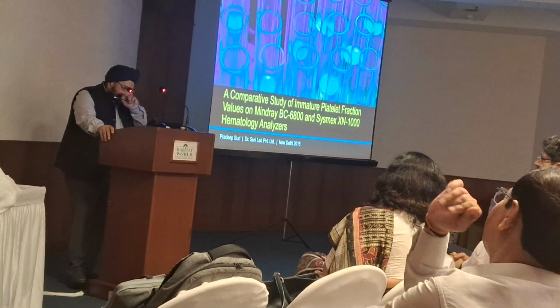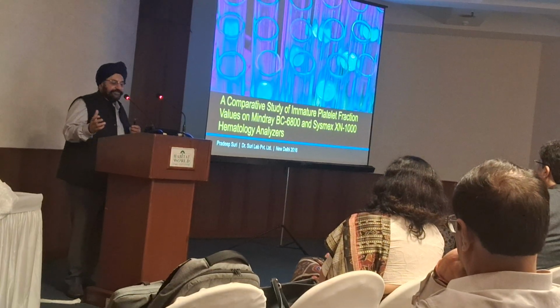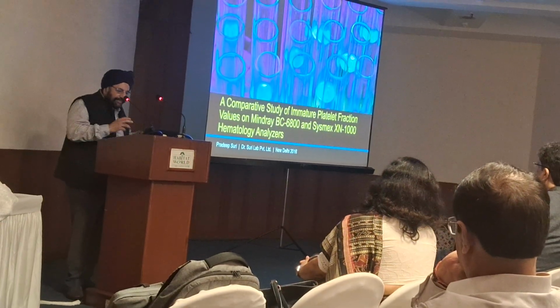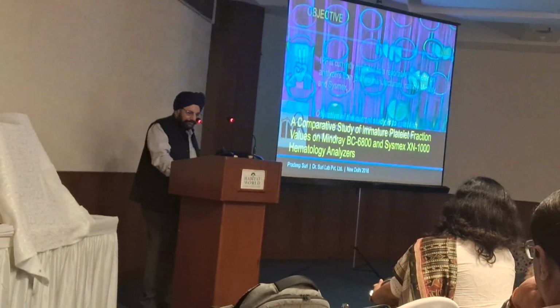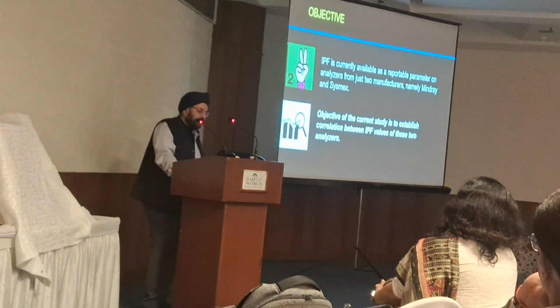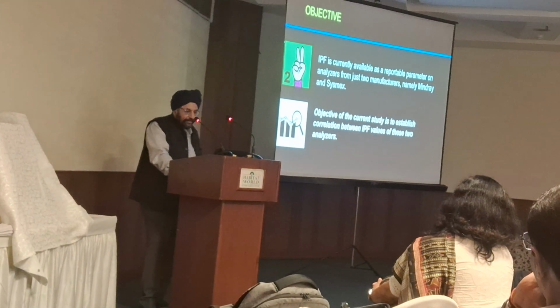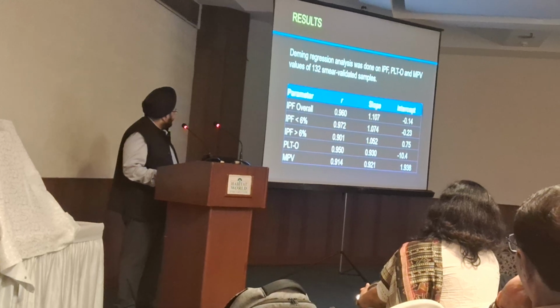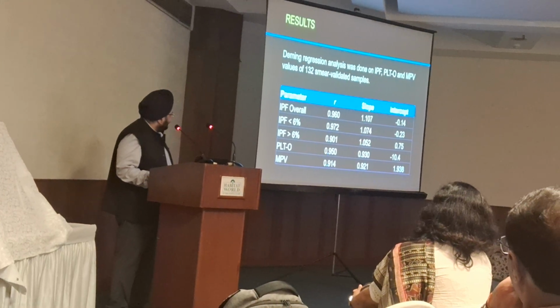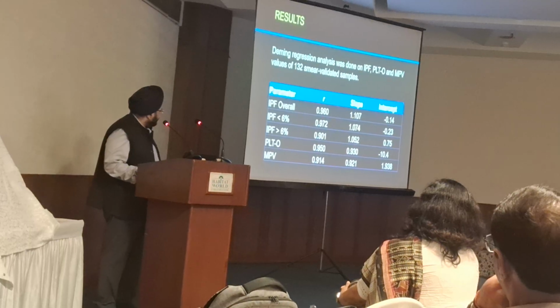Then we did another paper in 2016 where we were comparing 2 different analyzers, Mindray and Sysmex, and seeing whether IPF value trends change between these 2 systems. I had done this study jointly with Medanta Hospital since I don't have the Sysmex system. If you can see the Deming regression curves, the IPF overall R value was 0.960, for less than 6 it was 0.972, for more than 6 it was 0.901.